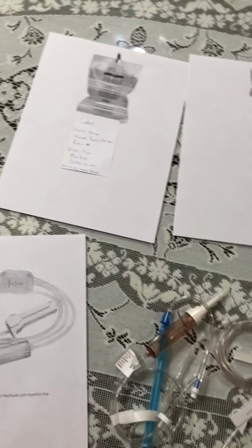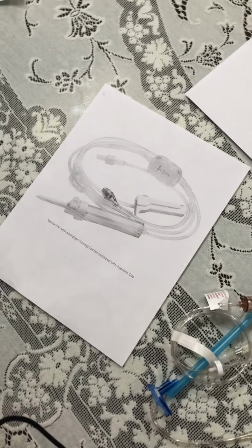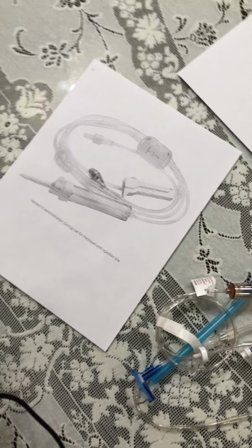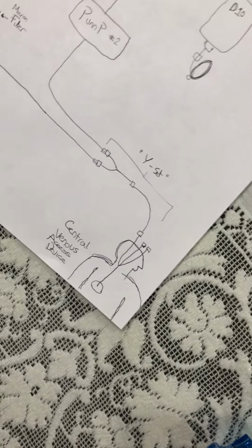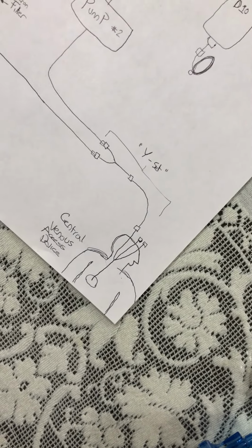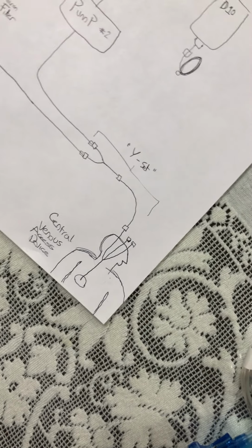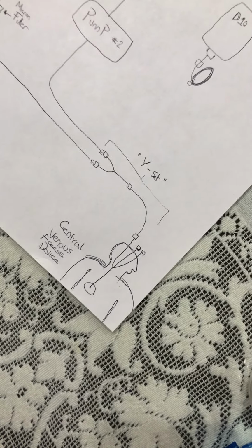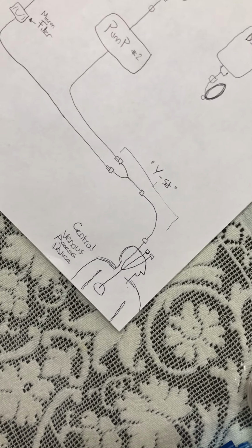Okay, so after I'm done grabbing all my pre-checks, I want to do hand hygiene, put on gloves, and assess my patient's central access device. I want to assess the site for any infiltration, which is indicated by pain at the site or leakage at the site. I also need to assess for any infection, which is seen by a rise in temperature or any chills in my patient.